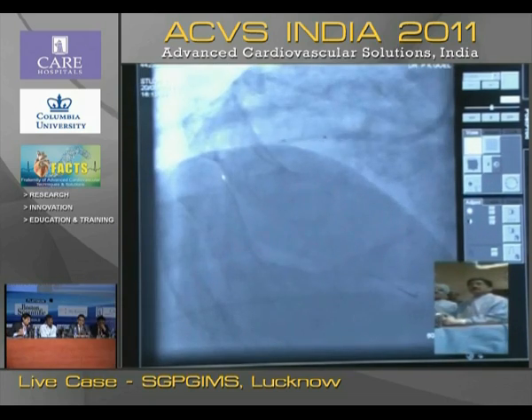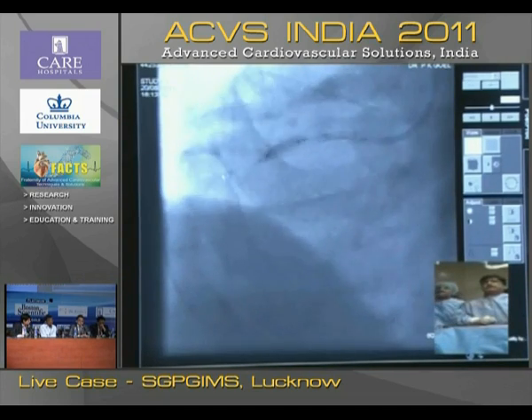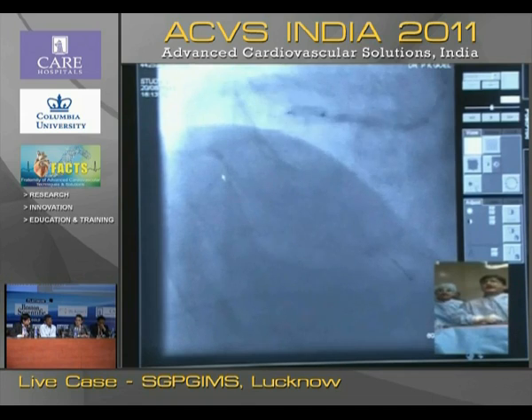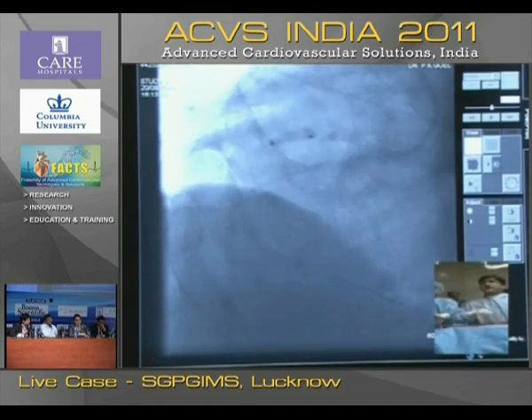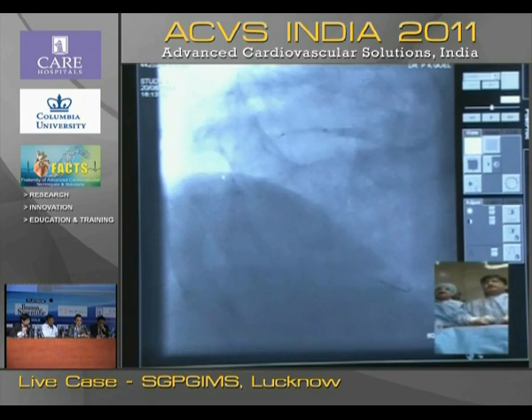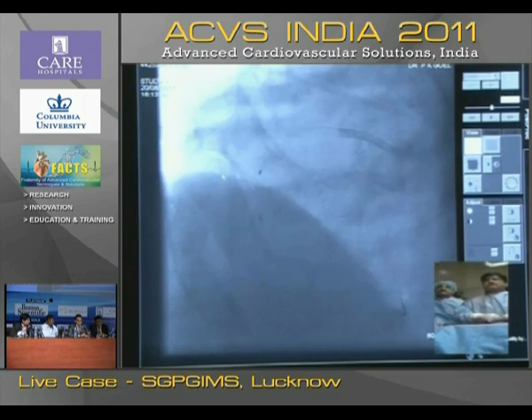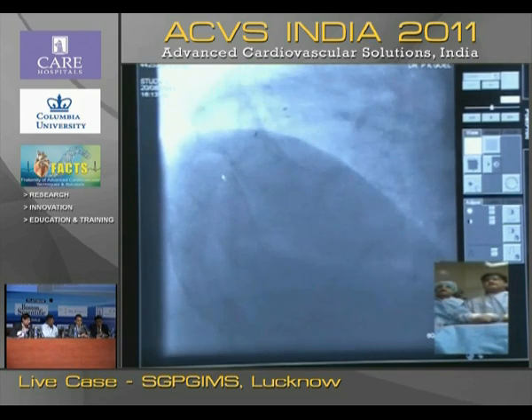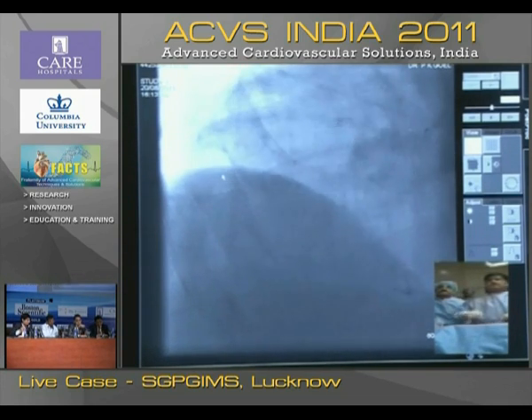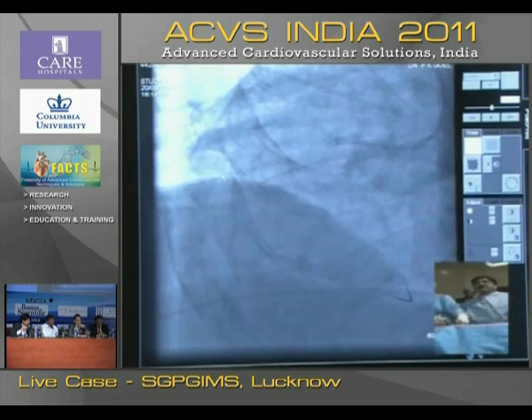Usually it is operator dependent. In the majority of cases, a microcatheter is useful because it won't affect the torqueability of the hardwire and the tactile feedback we will get. Suppose you take an OTW, it is easy, we can reduce one step. We can advance the balloon, dilate, and exchange with the soft wire. But the only important difference is that the torqueability of the wire will be affected.